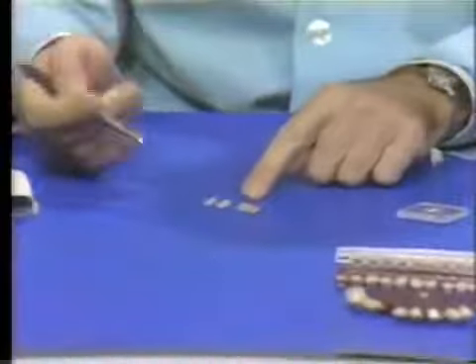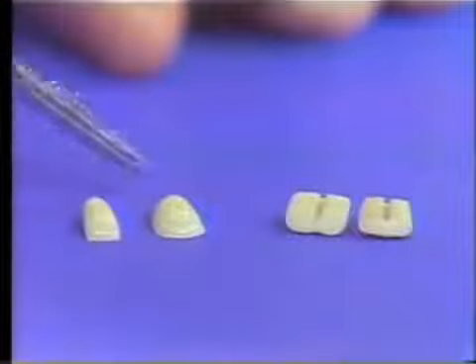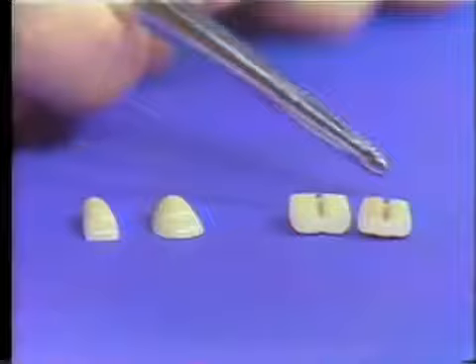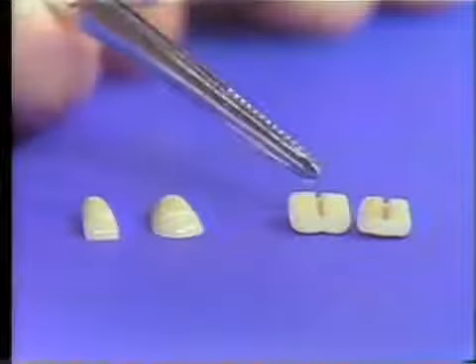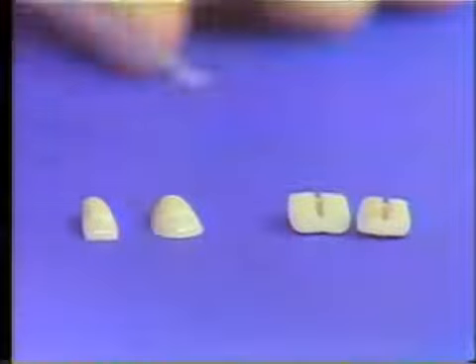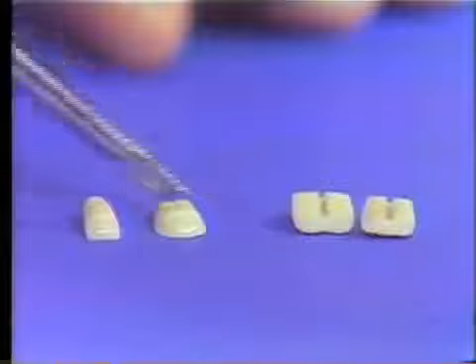And just down here we've got 4 facings. These facings are made for all teeth. Here's a mandibular incisor, a maxillary cuspid, here's a maxillary molar, and a maxillary incisor. And you can see here on the fitting surface the central groove that adapts to the backing. And these, of course, are the labial surfaces of this particular one. This one's got a mark across there, as you may notice.